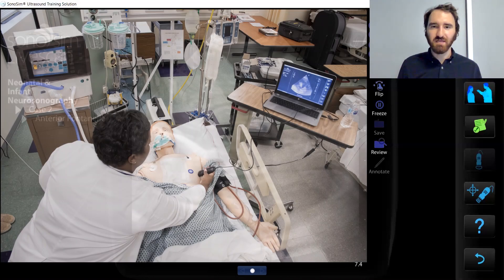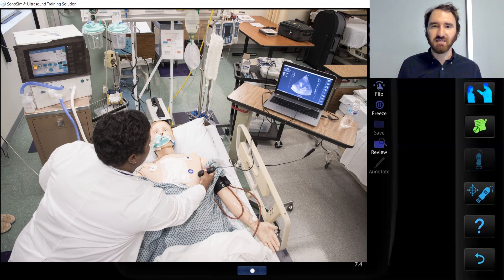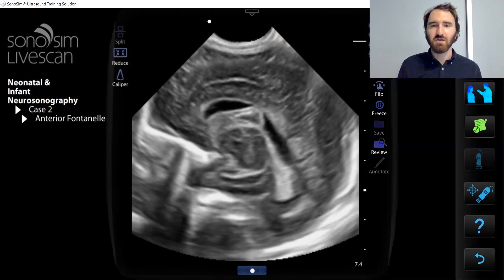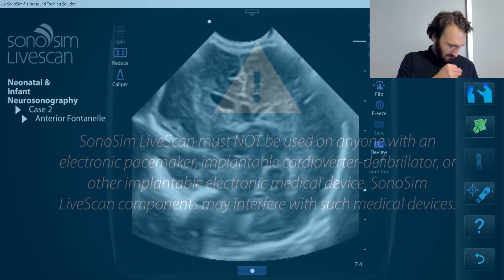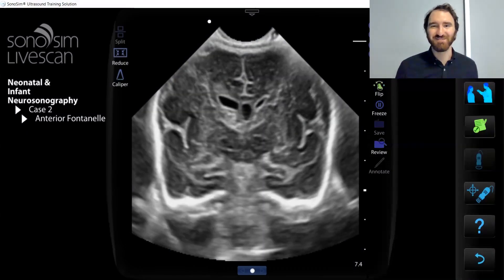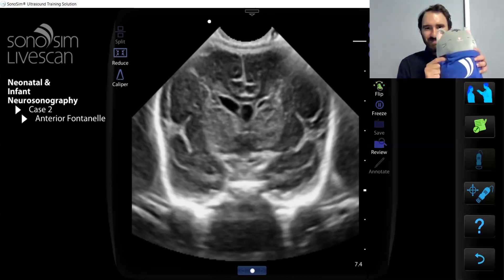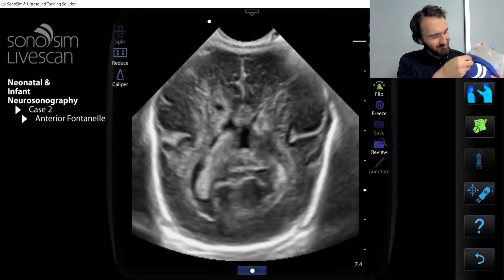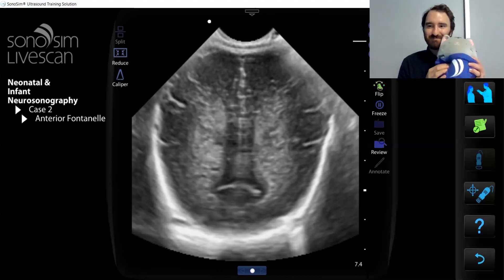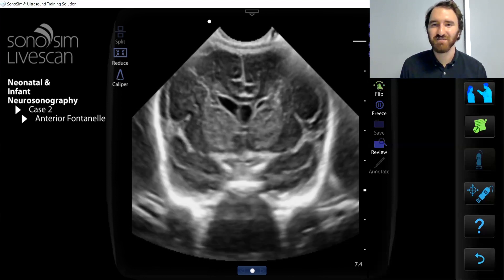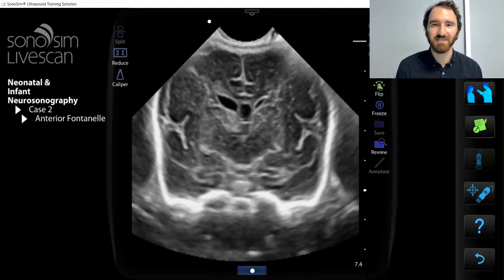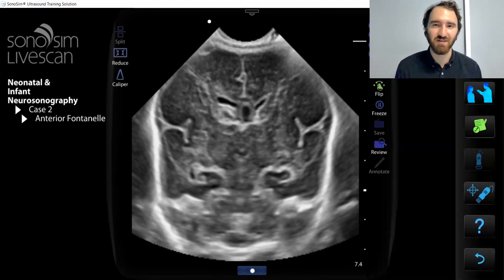If you are in a sim center, you can place the SonaSim LiveScan tags on any mannequin. Otherwise, you can place them on a live volunteer. You can even place them on yourself. You can even place the tags on a stuffed animal, like my friend here. With SonaSim LiveScan, all of these can be instantly transformed into an ultrasound training patient with pathologic conditions.